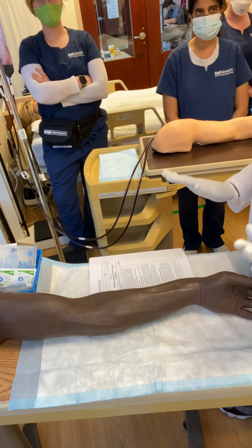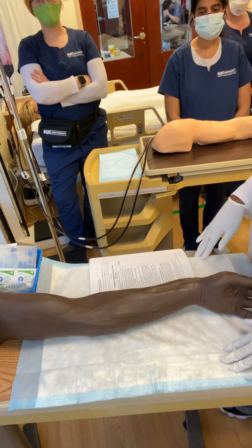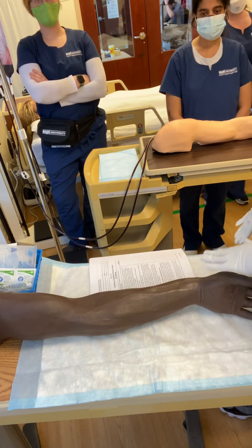We're going to make sure that we identify our patient. So I'm going to ask him, what is your name? What is your date of birth? Okay. Now we're going to get all of our equipment ready.